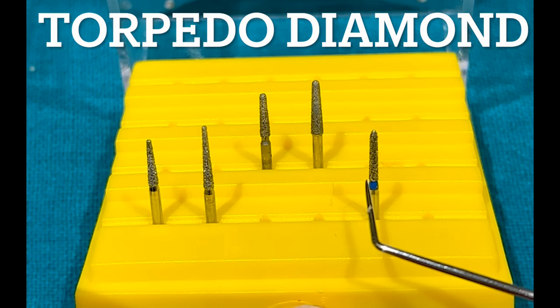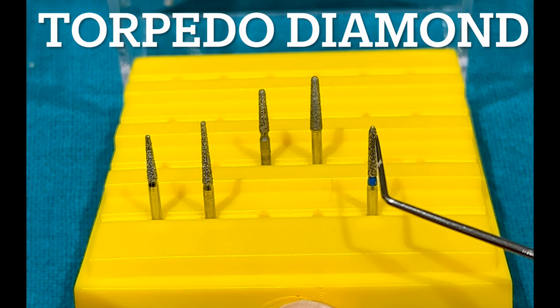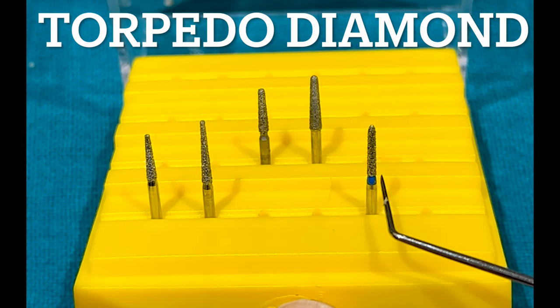This is a torpedo diamond. These burs have straight sides and a bevel-shaped or torpedo-shaped tip, as you can observe.